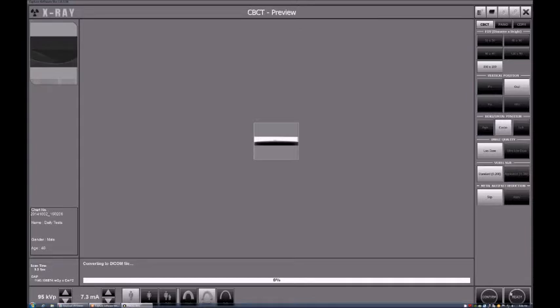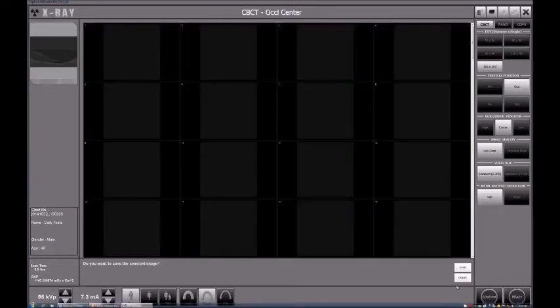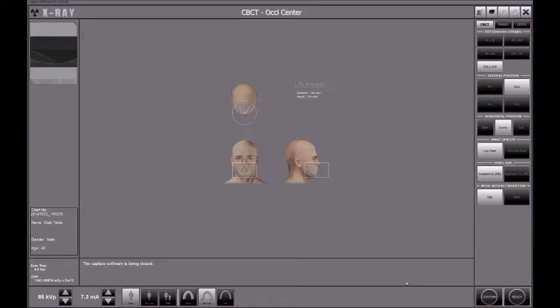And then we will be able to see the CT scan that we just took in the patient chart that we selected initially to be used for this test. I called my patient chart daily tests. That way, I can just use that one and remember its name more easily, and use it every single day for all these tests. So I can just keep all my daily tests in one single patient chart for recording purposes.